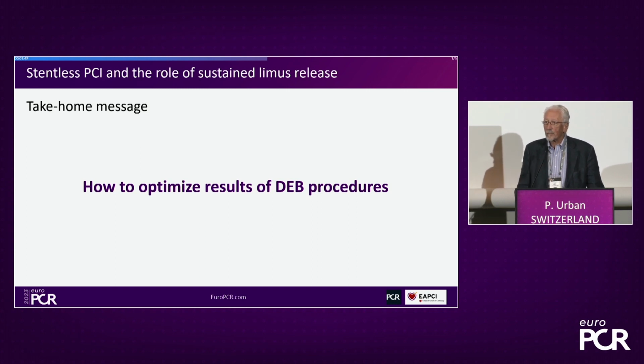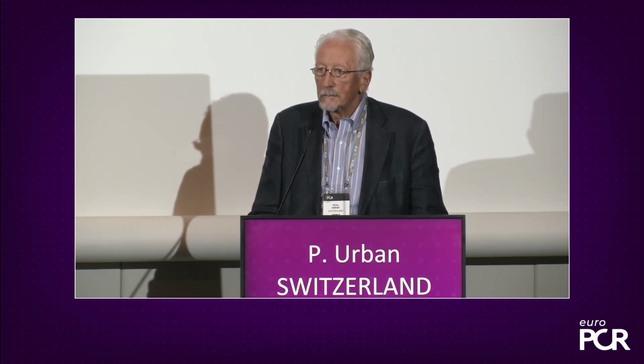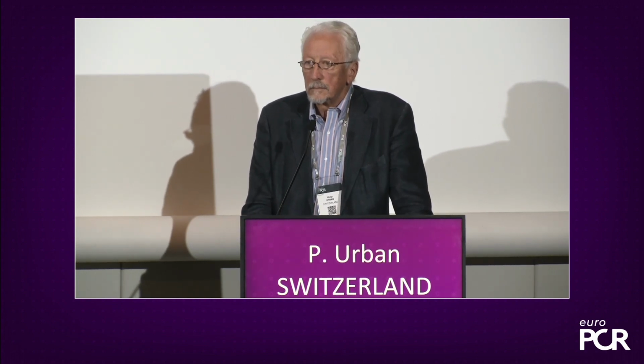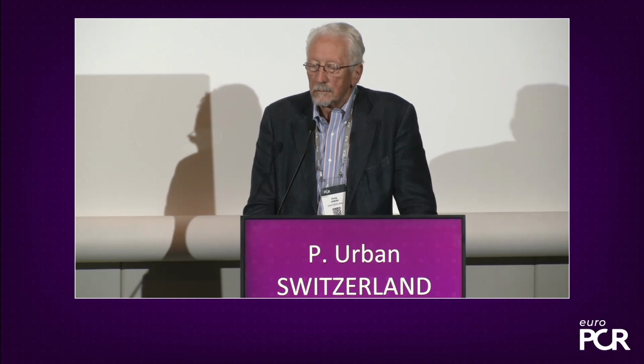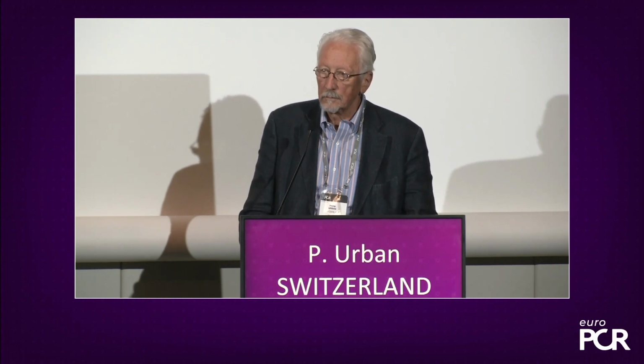Sir. Yeah. No, just to emphasize this fact, because this is the most frequent anxiety amongst people when they are using DCB. And let me tell you, in the last 2 years, we have used about more than 800 DCBs. And no acute occlusion. Absolutely zero. Various kinds of dissections, sometimes even longer. But the use of, as Peter told, imaging and physiology is the most important thing, and good vessel preparation. With the Wolverine or cutting balloon, we go up to 18, 20 atmospheres, no anxiety. In that kind of lesion, if it is not responding, go ahead. Don't worry, we have to get a good lumen to start with.